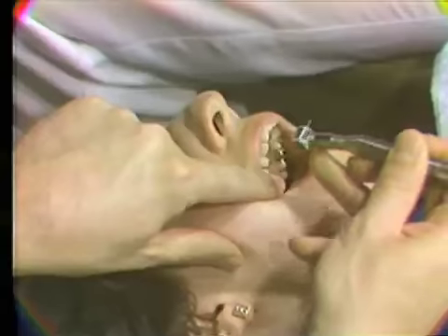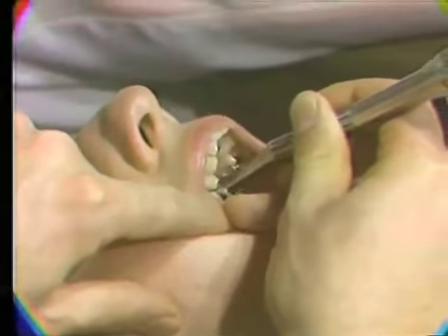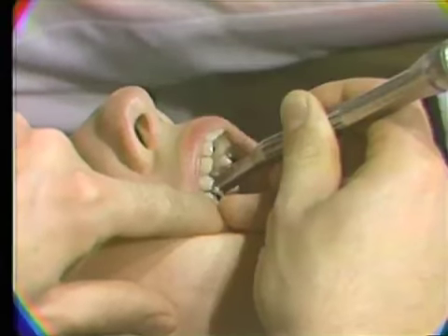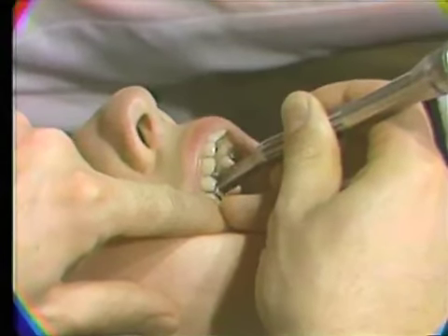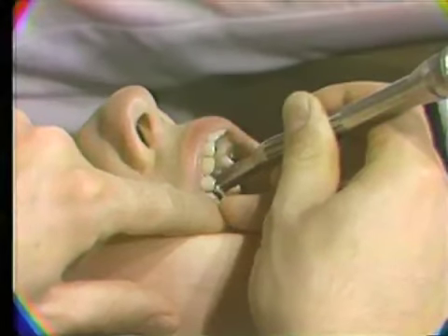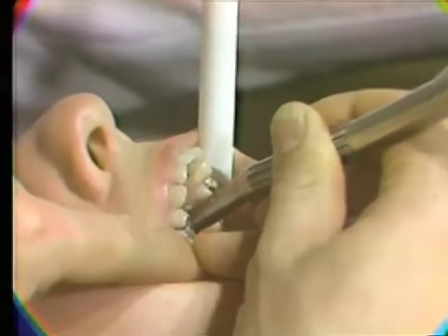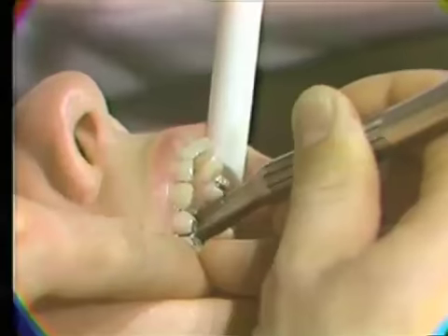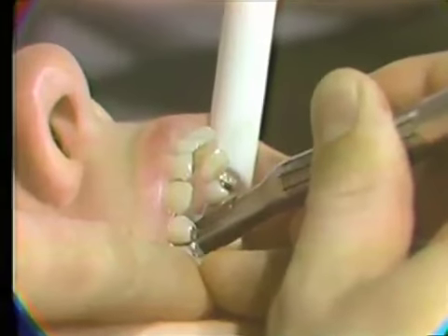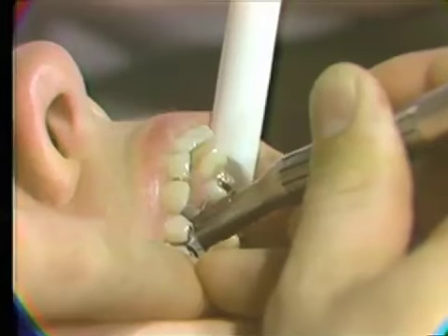Stability for the operator is accomplished by establishing a finger rest on top of the operator's left index finger, which is placed over the occlusal surfaces of the maxillary right bicuspid teeth. The operator's left index finger not only provides a favorable finger rest, but also retracts the right cheek for improved visibility. The left cheek is retracted by the chairside assistant using the evacuator tip placed at the buccal surface of the tooth being treated. The opening of the tip is directed toward the handpiece with half of the opening placed below the occlusal surface of the tooth being treated.